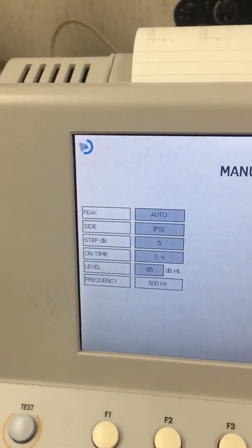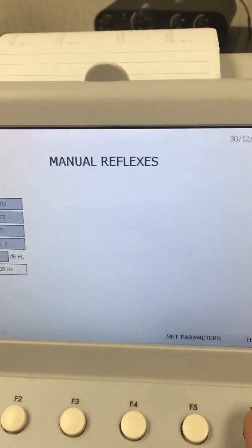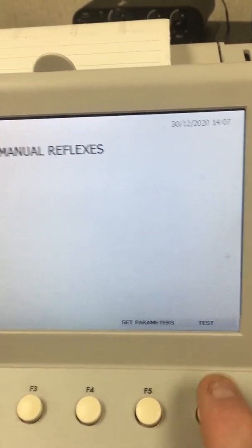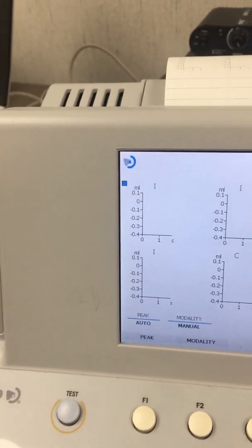So we're going to highlight the one we want to do. We want to do the 500 and then we're going to go over to F6. We're going to press start test.